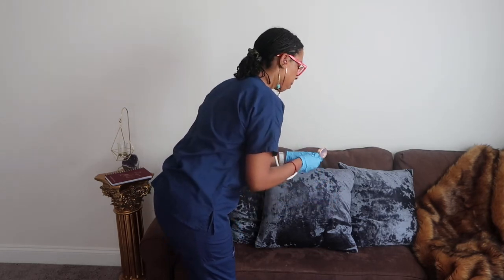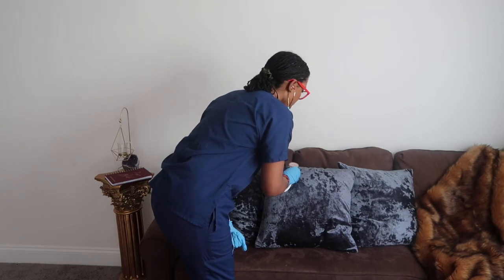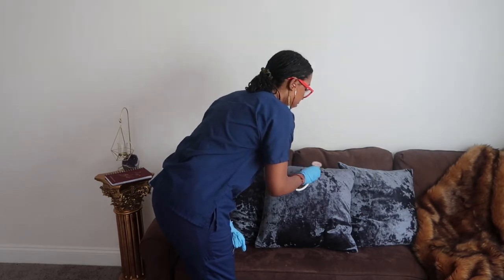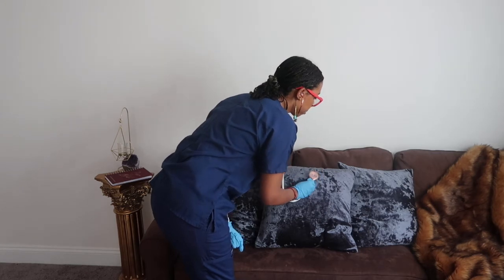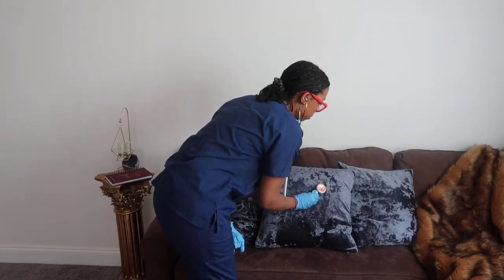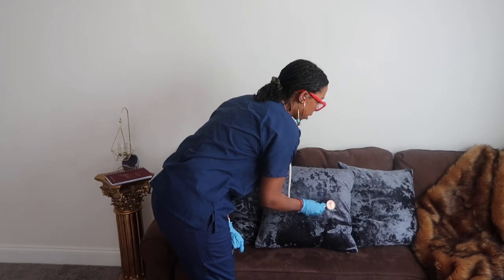I'm going to flip it to the bell side — listening for any murmurs. The aortic valve, pulmonic valve, Erb's point, tricuspid valve, mitral valve.